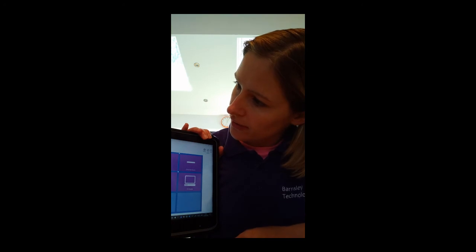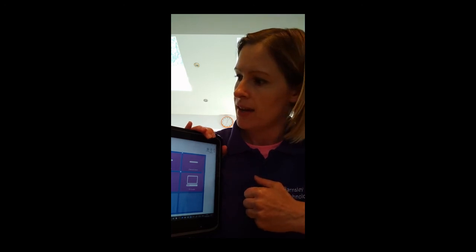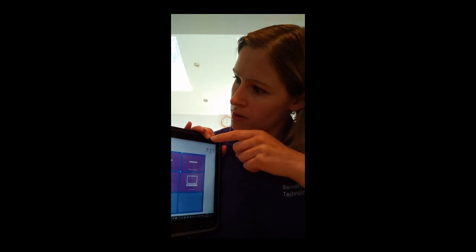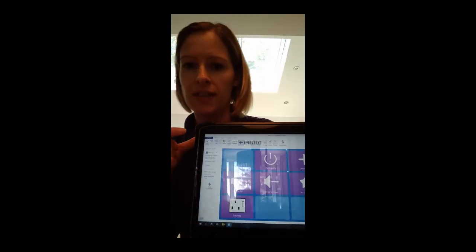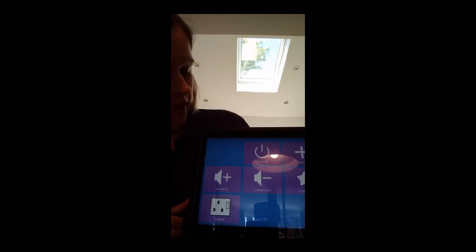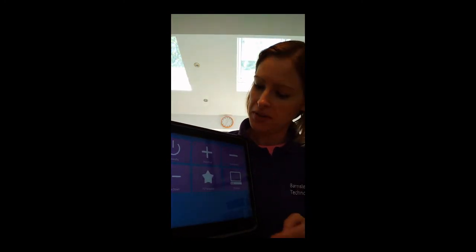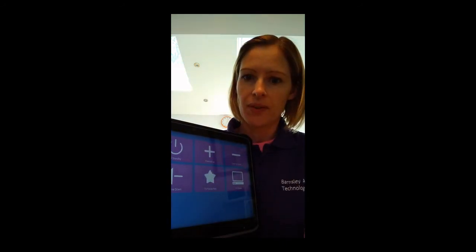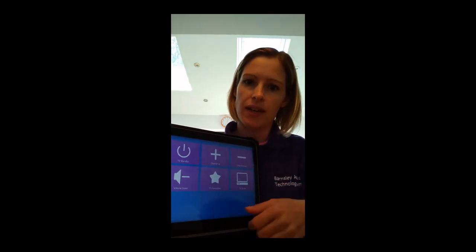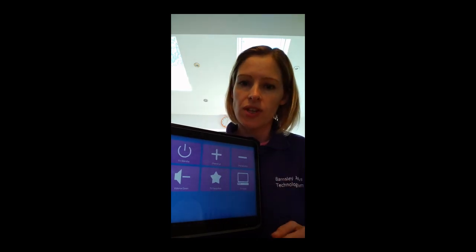Once you've done all the buttons, you need to come out of editing mode and make sure everything is saved into the device. Up in the top corner of the screen it says Finish Editing — click on that and it goes back into normal user mode. Then try out the different buttons on the screen and check that they work. If any of them come up with an error message, go back into editing mode, record the button again with the remote control, and check that it's working.